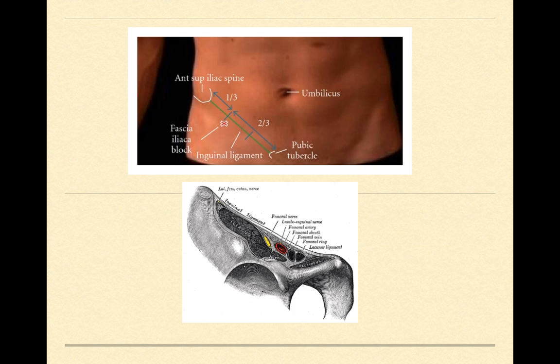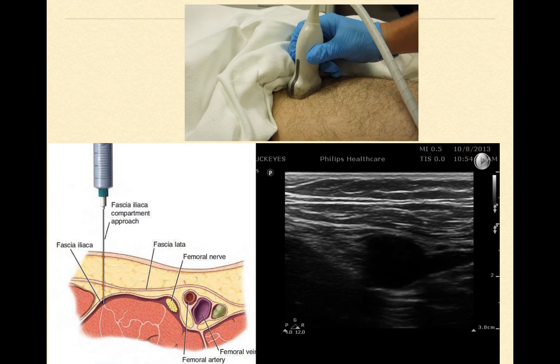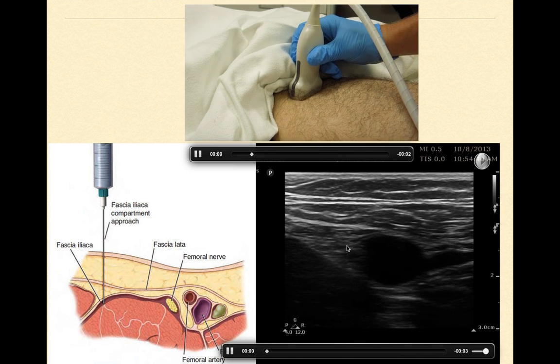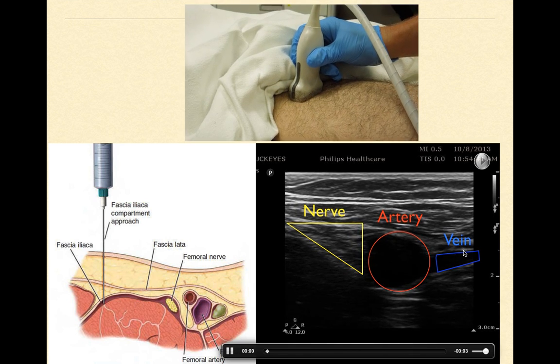Where are we doing this? In general, just where we're going to be putting in central lines. So right in the femoral bundle, right along the inguinal ligament, is where you're going to be orienting your probe. And this is the anatomy that you're going to be seeing with your ultrasound. Here it is in real time, top of the screen. This is the right leg with the corresponding right ultrasound image. You can see in the middle of your screen here is your femoral nerve. Here's your artery. Here's your vein. Nerve, artery, vein. Okay.